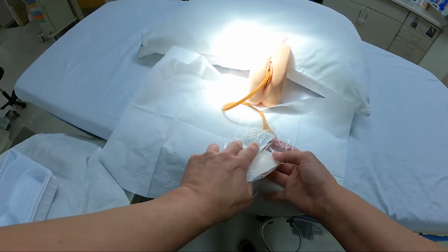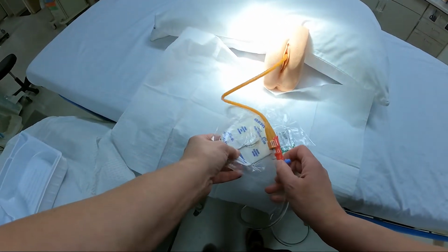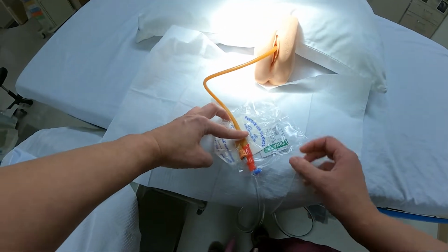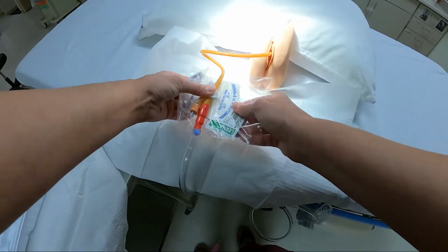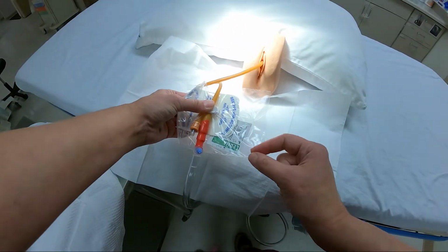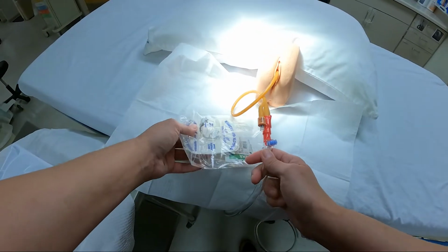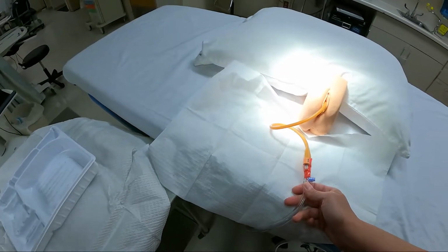There is a skin prep here to keep the adhesive from doing anything bad. You put that on either leg, and then you go ahead, these fit in there like that. That snaps over, just like that. And then this goes on their leg. Now, when it comes time to take it off, please put alcohol on there to take it off. Don't rip it off their leg, because they're going to be missing some skin and thinking about you for a while.